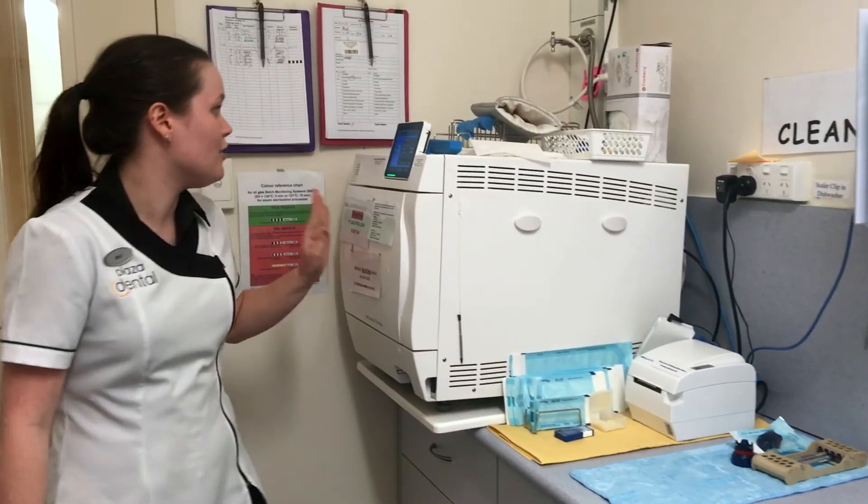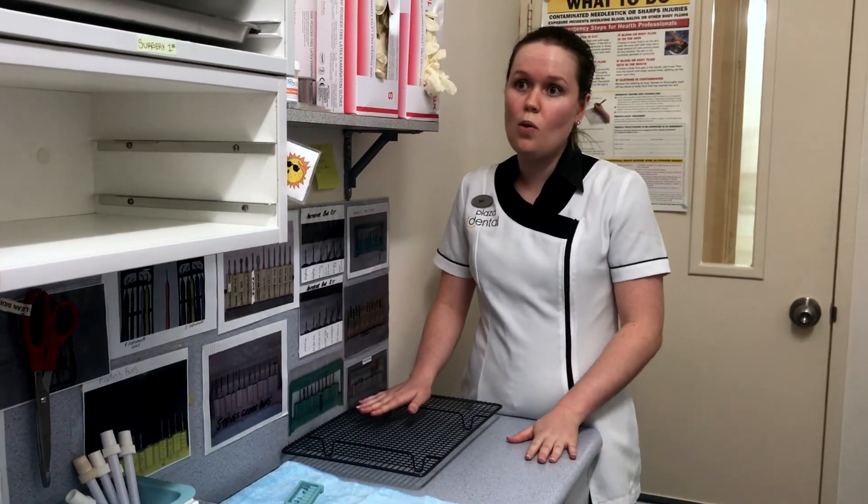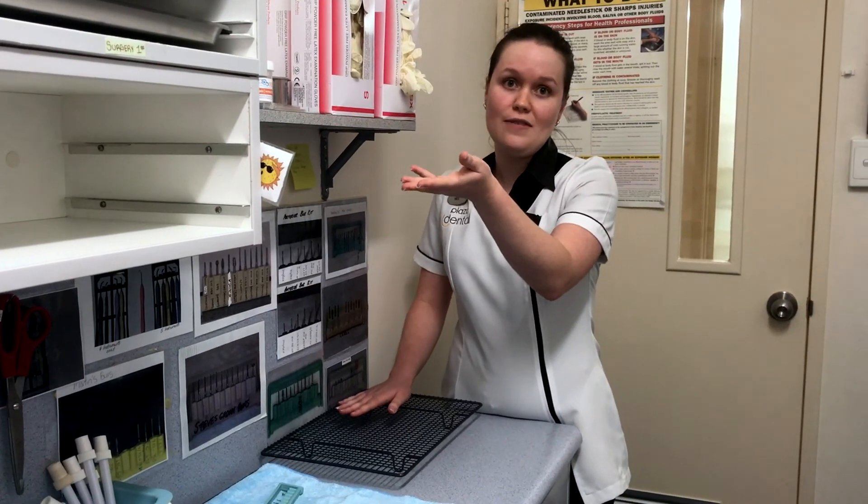Once they're also out of the autoclave, they come over here where we inspect them again before placing them in the drawers or on our clean trays, ready for the next patient.